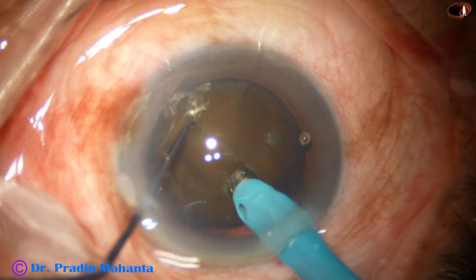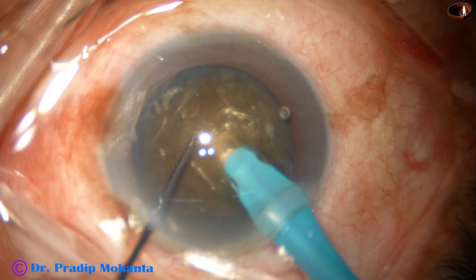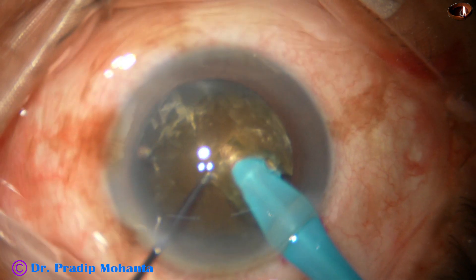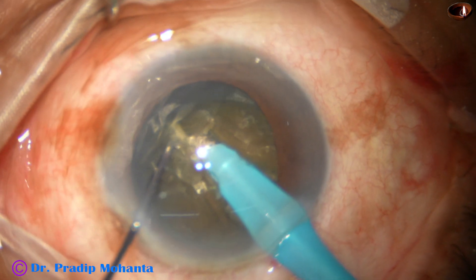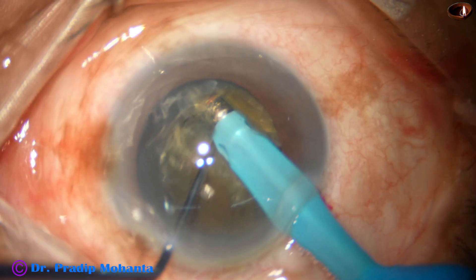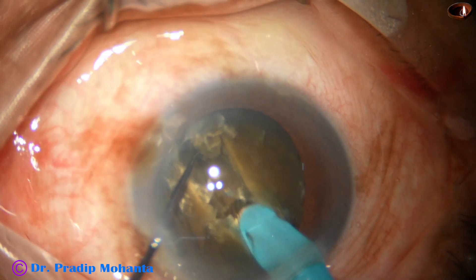The first attempt is submarine chop technique. The tip is buried into the substance of the nucleus and goes through the nucleus with full energy towards the opposite equator. It crosses the hard part and reaches near the opposite equator, and then I use the chopper to get a deep, nice crack.